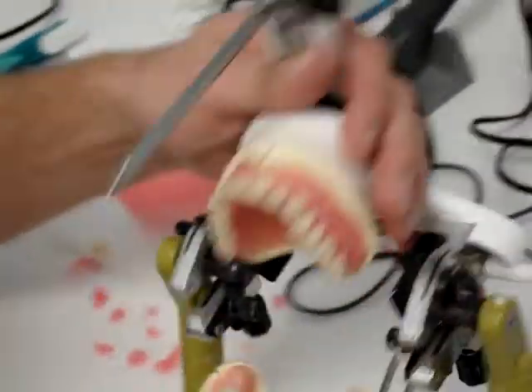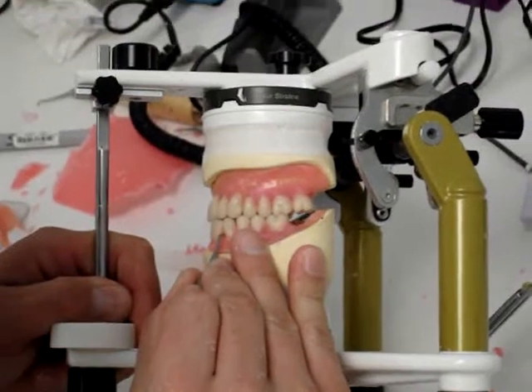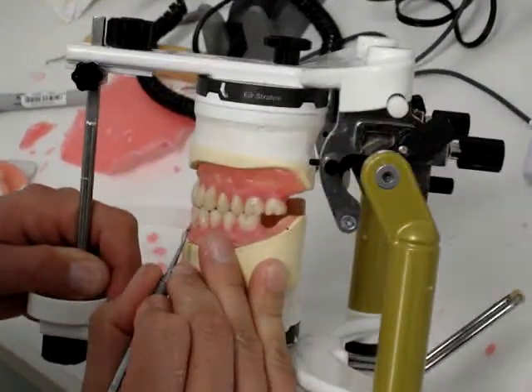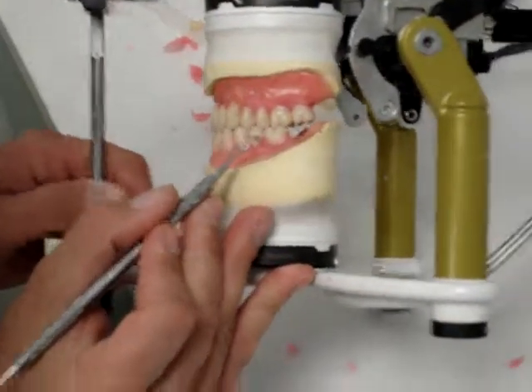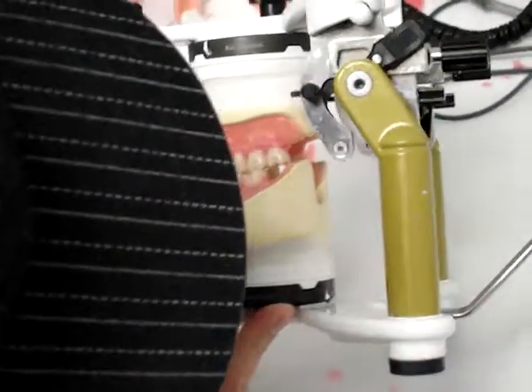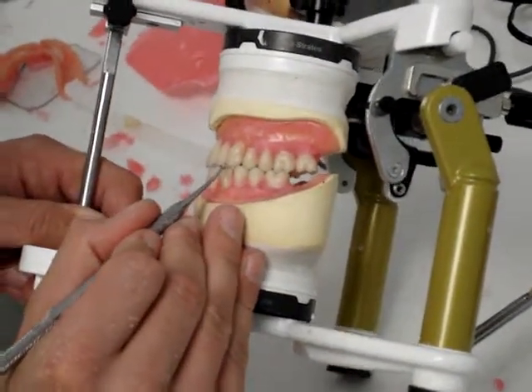What I'm doing now is moving this canine just ever so slightly so that it's touching in excursives. Now I have almost all the excursive movement contacts: one, two, three, four, five, six, seven — we even picked up that one somehow — eight. That's pretty good excursive contact.